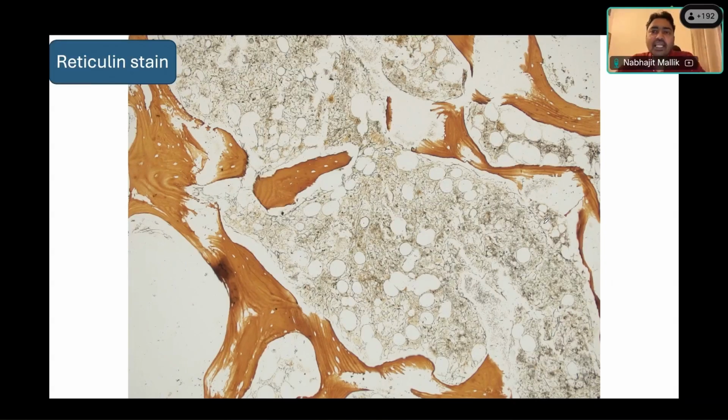Right. So we think that is probably a myeloproliferative neoplasm, right? And also remember, in the history, the patient had some slight spleen, which was also palpable. So there is a splenomegaly. Elderly lady has a lot of hypercellularity. That is also a very important finding: we have hypercellularity, increased megakaryocytes, and some basophils in the peripheral blood. And these megakaryocytes show abnormal localization in the form of paratrabecular clustering, and we have some mildly 1+ kind of a retic.